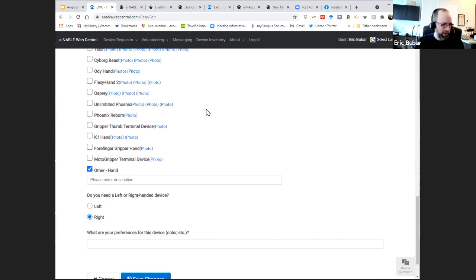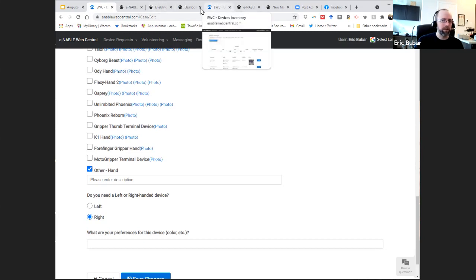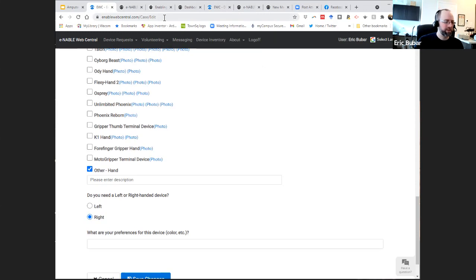This is going off of Marianne's other question. Are the 3D arms heavy to use? I have a bionic arm and it is heavy. I've seen that described in a lot of places, that the myoelectric devices are ridiculously heavyweight because they're machined out of metal. They have very heavy duty machinery inside of them, heavy batteries. So they are quite heavy.